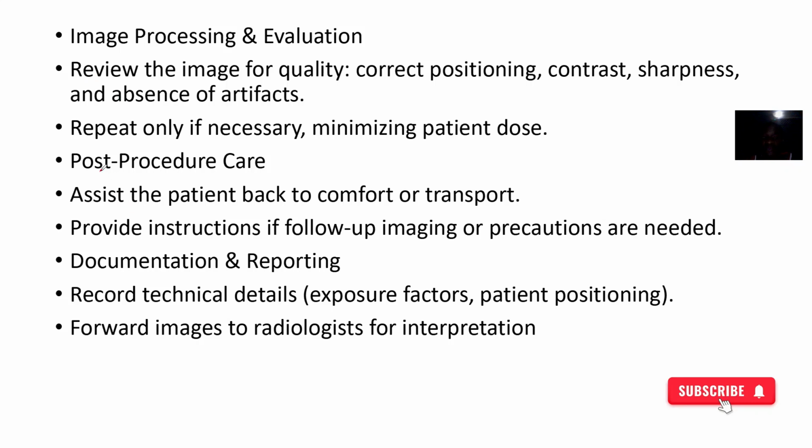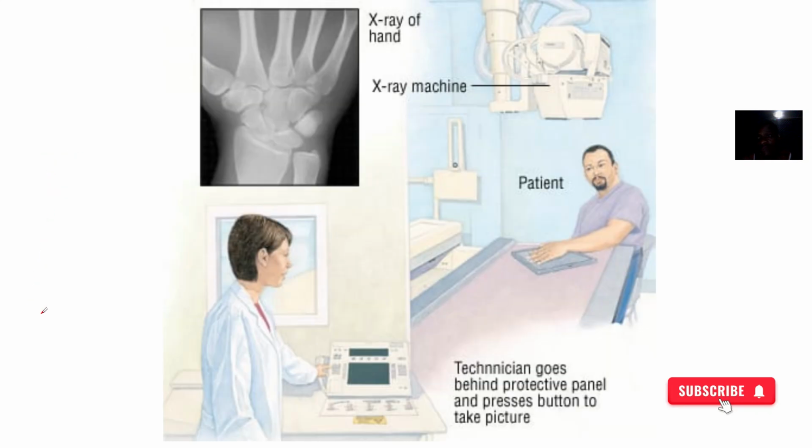So after the procedure, don't just leave the patient. You have to assist them back to their comfort. You also document everything that happened within that procedure.